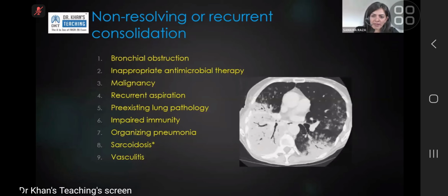At the second follow-up time, if you still see slow, subtle, incomplete resolution, that again comes down to the appearance at that time. You can either let it go then, or if it worries you, you can recommend a CT. Most slow resolving consolidations have improved by the time of the second follow-up, or have improved enough for you to dismiss them.